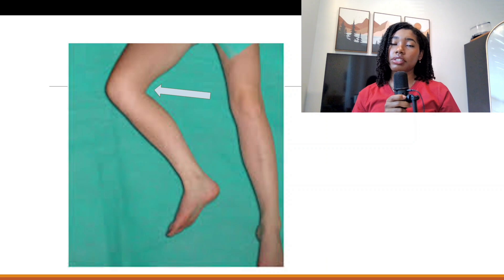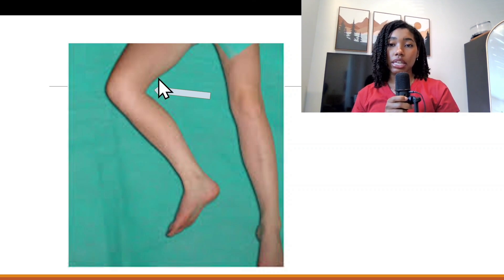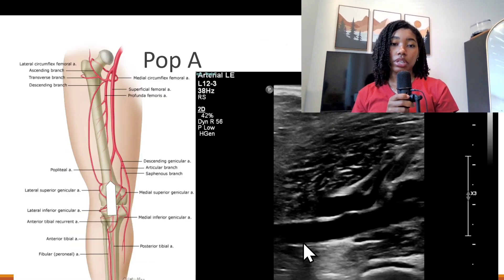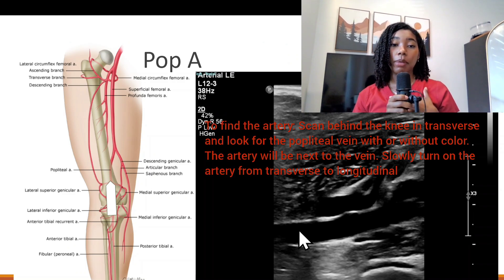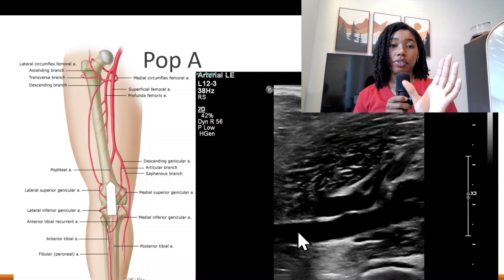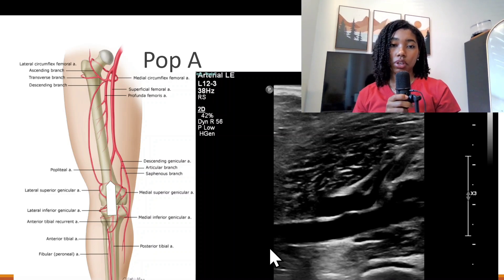Make sure the patient is in the proper position — they may need to bend their knee slightly more so you can access the popliteal fossa. The transducer will go behind the knee to image the popliteal artery. Take the popliteal artery images proximal to where the anterior tibial artery branches off. Before that bifurcation is where you want the majority of your image — focus on that part.